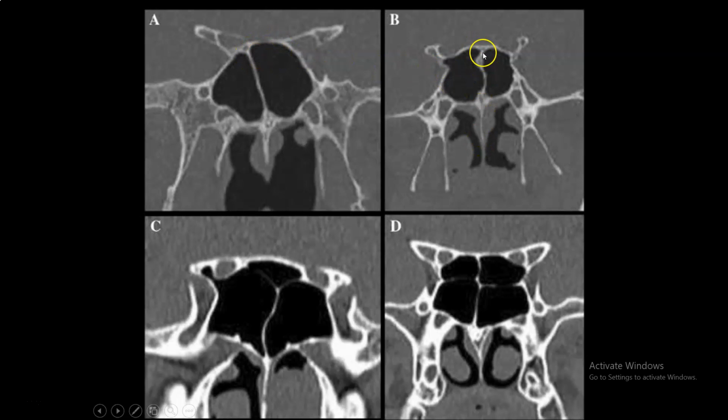This sinus is strictly in the midline, so the midline is where the septum is. This sinus has two branches, so we have to identify the midline in relation to this. And here they have four divisions, dividing the sinus into four spaces, which could happen. You identify the vertical septum, and the midline is almost here. So in every case of transsphenoidal surgery, you have to do a coronal CT. The MRI is not enough because it doesn't show the bone in detail.